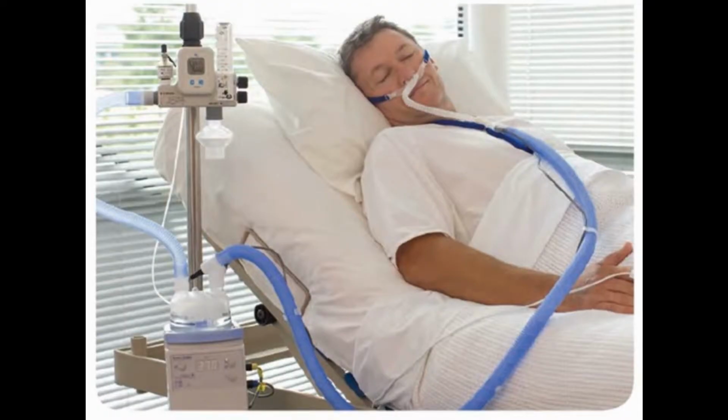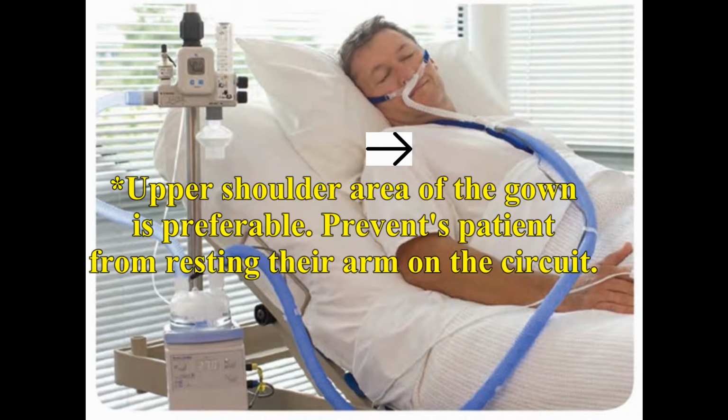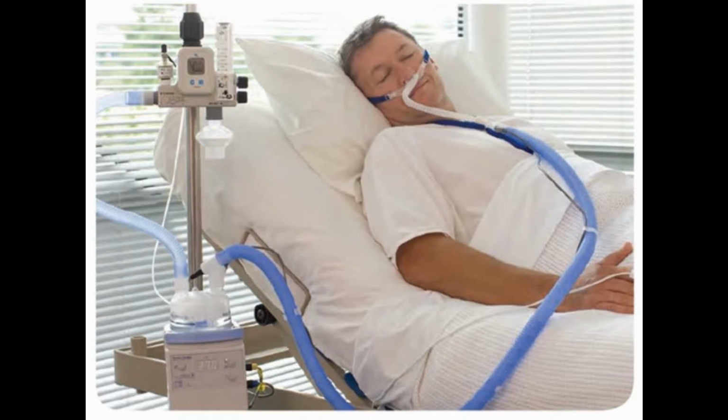Okay, so I'm just going to make this short because I didn't do my mannequin piece. Now you can see the proper orientation. The strap obviously fits around the patient's face, over the ear, to the back of the head. Yes, this one is the older OptiFlow. It has the necklace, so it bears the weight of the circuit, so it's not pulling on the patient's nares. What's different with the newer ones is that instead of the necklace, it just has the little clip that I showed you in the previous clip from Grady, and you would just clip that around the adapter piece part of your cannula, and clip it to the gown, and that's it. That's pretty much all there is to securing that to the patient. So now let's get back to the conclusion segment.